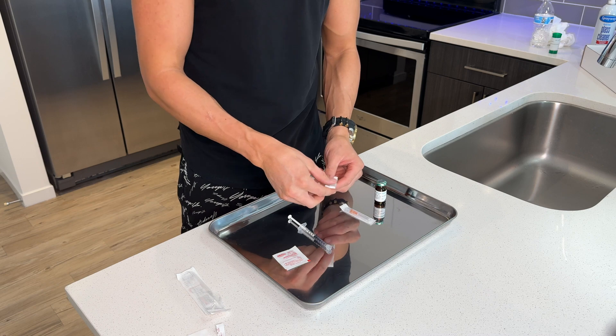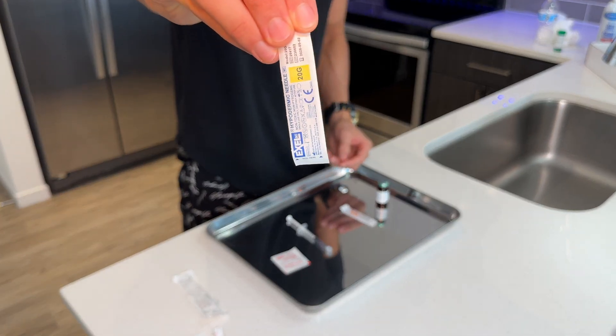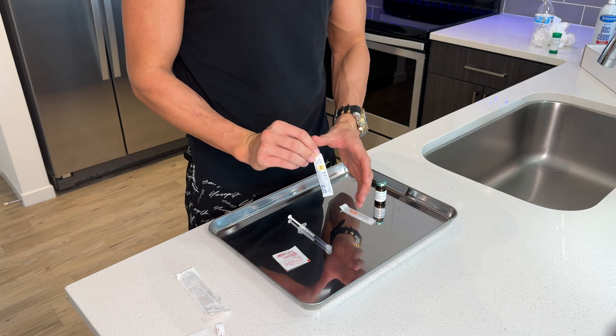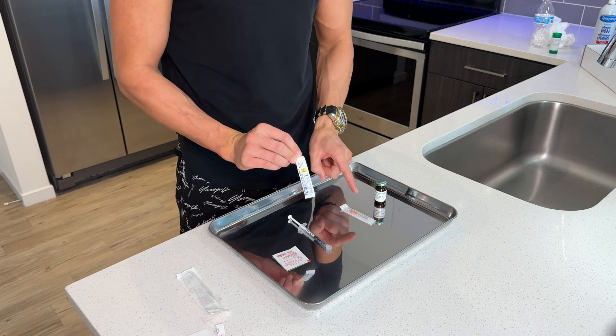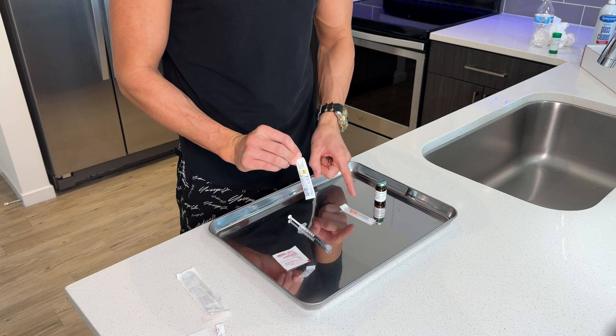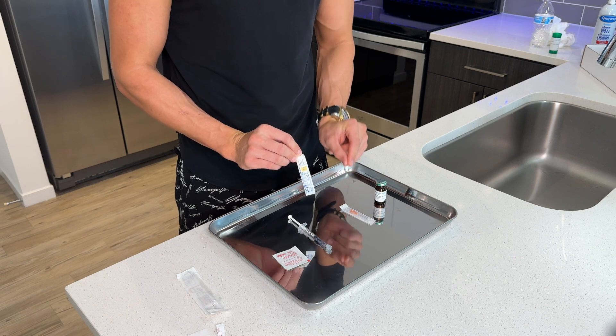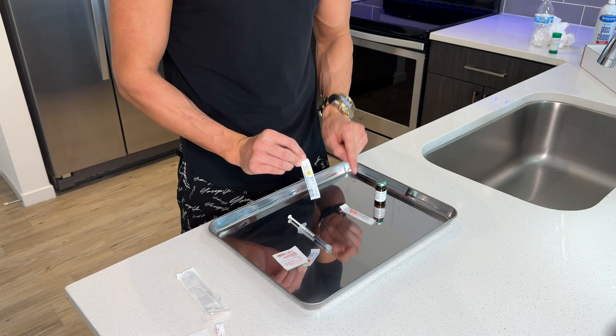Once we have it pulled back to 0.5, we're gonna take out our drawing needle, which is a 20 gauge one inch needle. Now, there are a lot of clinics out there that are only going to give you one needle. This is a huge problem because if you were to draw the testosterone and inject with the same needle, you're actually dulling the tip of the needle when you put it in the vial to draw out. And when you go to inject, it's gonna be a lot more painful.